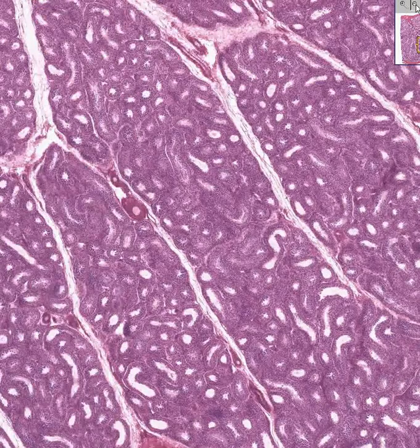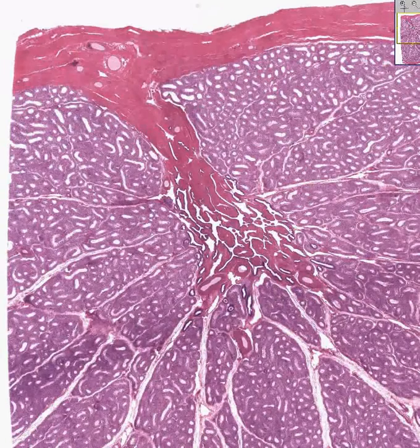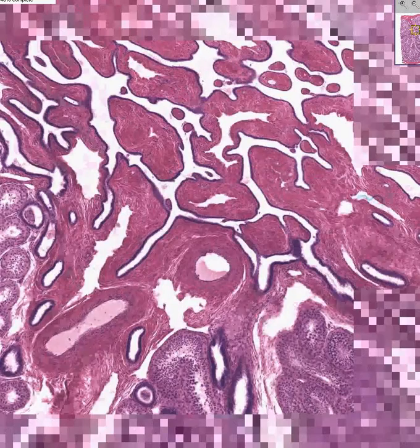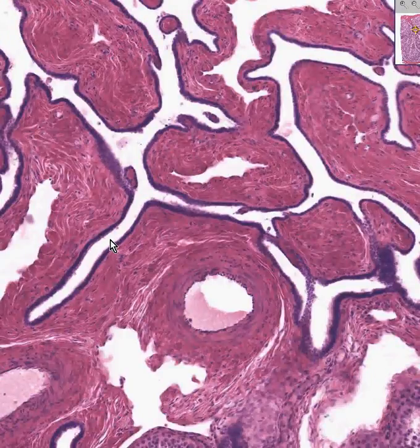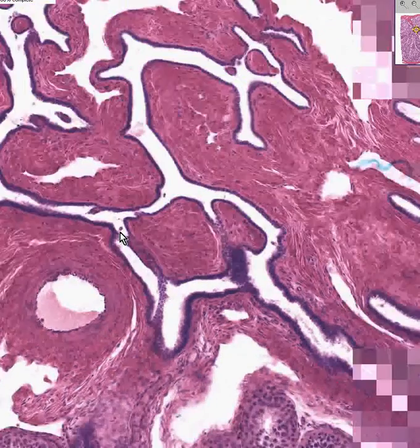And the mediastinum of the testis, as you could guess, is kind of in the area where the testis is cut, and you can see it's a little bit more fibrous. And the mediastinum of the testis, generally called the rete testis, R-E-T-E, because it looks like a little network, looks exactly like this. The epithelium is extremely flat, certainly maybe cuboidal or low cuboidal, and it is lining areas which are rich in fibrous tissue and blood vessels. This is a classical appearance of a rete testis, also known as the mediastinum testis.